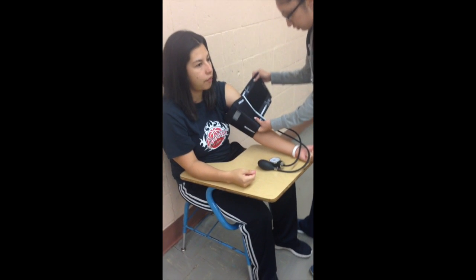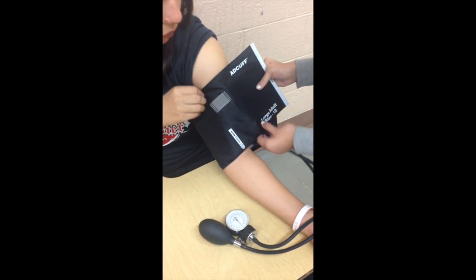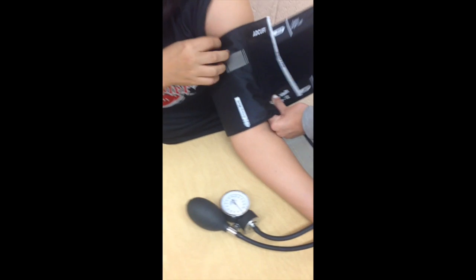You are to wrap the cuff firmly around the upper arm, aligning it with the brachial artery. It is important that the correct cuff size be used in order to get the most accurate measurement.